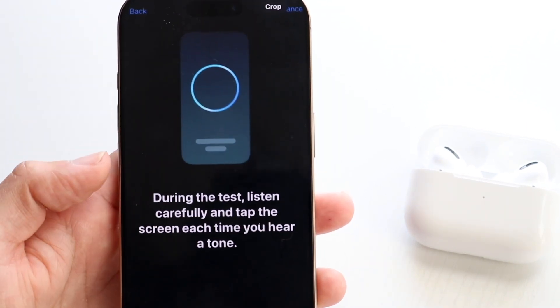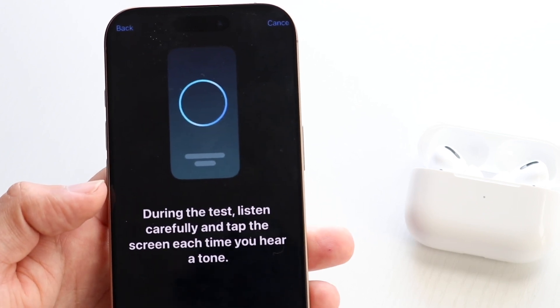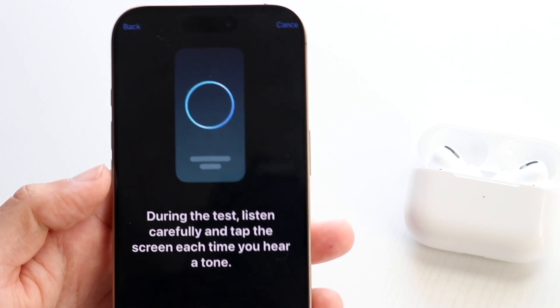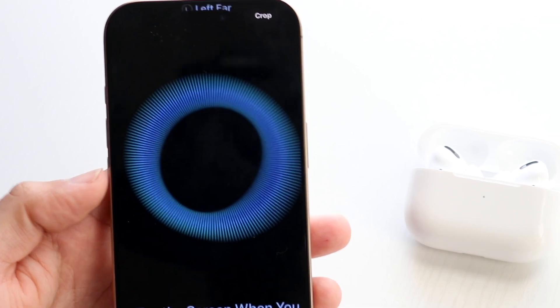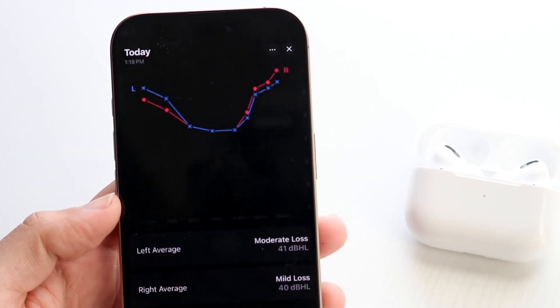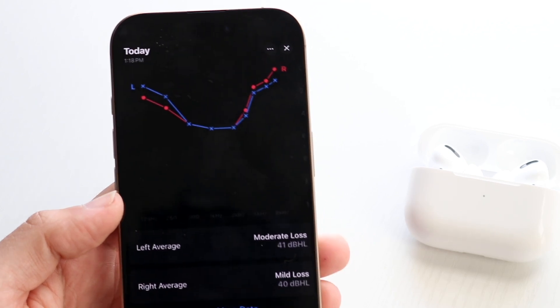Once you continue, it will give you a breakdown of the test. It'll say to listen carefully during the test and tap the screen each time you hear a tone. Follow those on-screen instructions. It will play tones — just follow along. Then you'll be able to finish up the test.